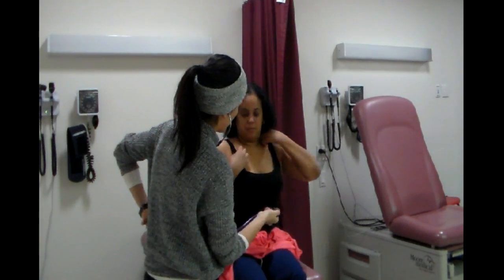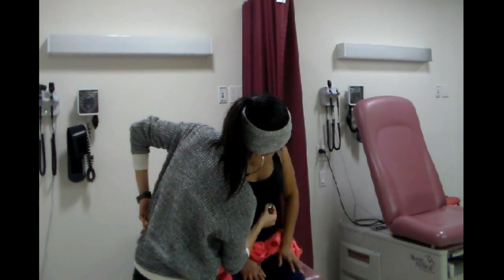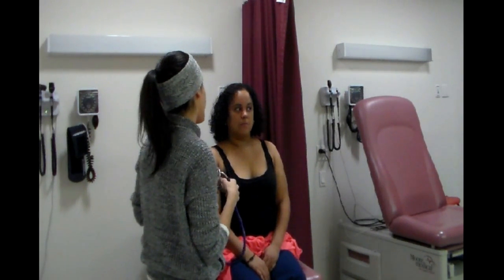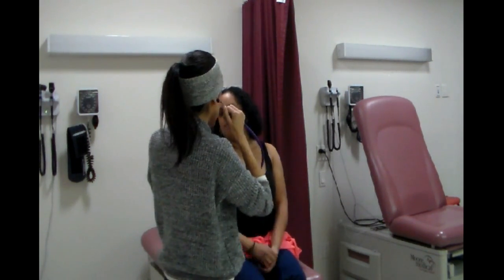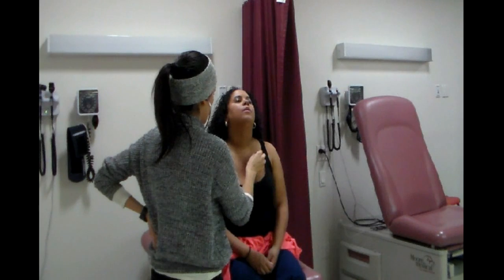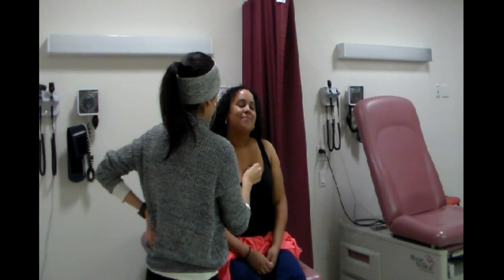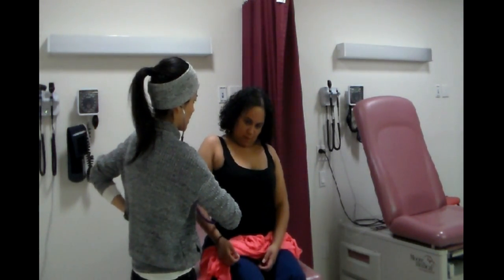Okay, and then if you can just lean forward for me. And hold your breath. Okay, I don't hear anything. So now I'm going to listen to your lungs, okay? Take a deep breath through your mouth, and out your mouth. And I'm going to listen over here, underneath your arm. Deep breath.